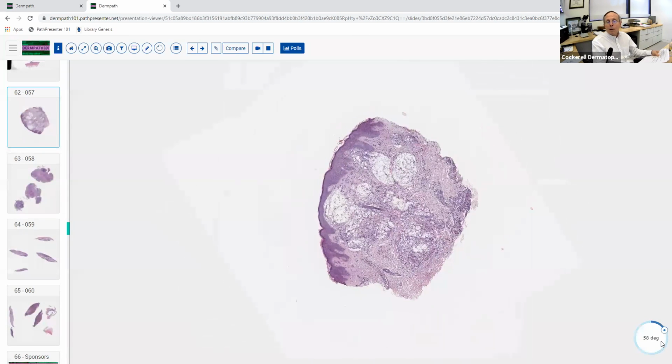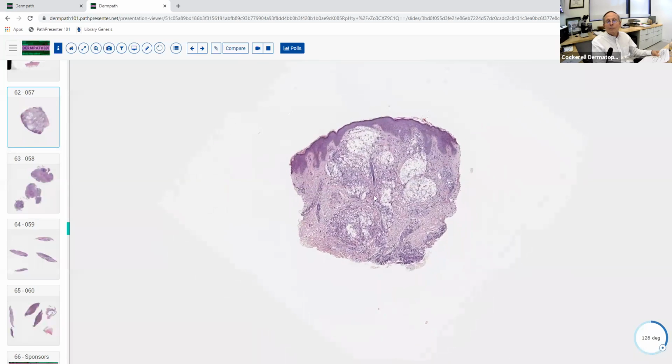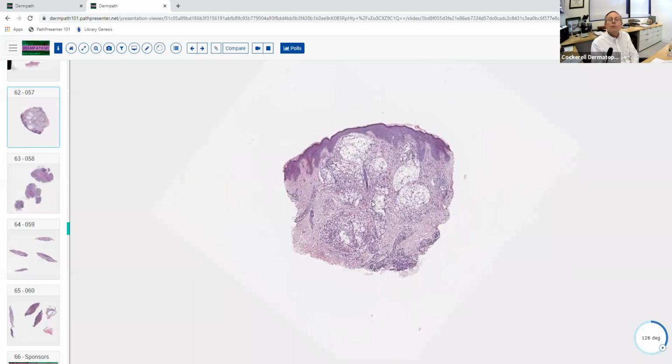So we've kind of ended up our session today with some interesting mixture of neoplasms plus some inflammatory things. And we want to hit some of these infectious inflammatory things because the board likes to ask them. Once again, these are incontrovertible. No one can ever question an infection because it's proven.